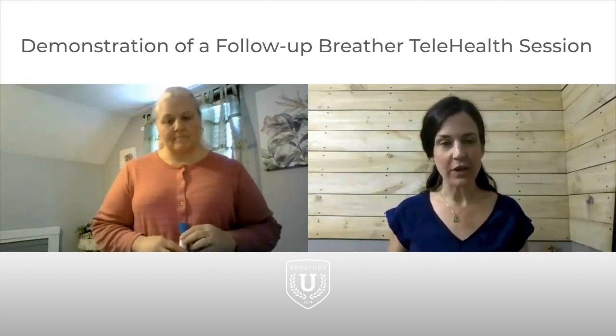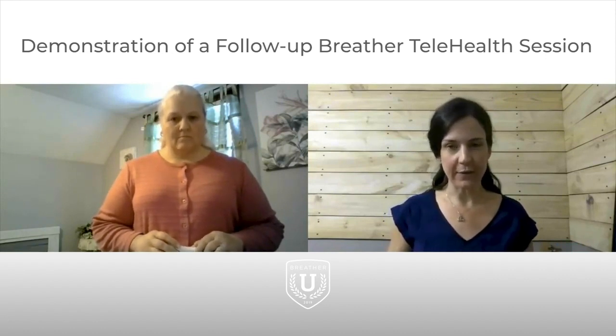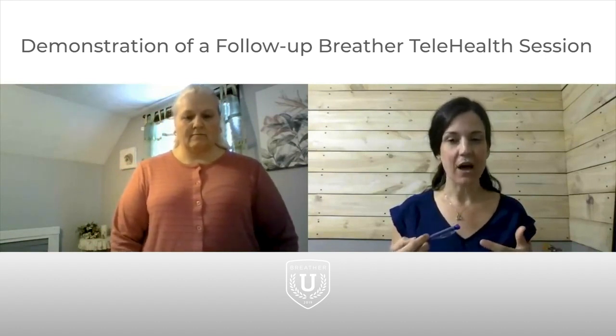Yes. Very good. Okay. Today, the first thing I want to do is check where you are on those measures that we did the first day on your evaluation so that I can see how you're doing with your progress. One of the ones we did was your maximum phonation time. So I'm going to ask you to take a deep breath and say, ah, as long as you can until you run out of air. Okay? Give me a second to get my stopwatch. I'll show you at the end. Whenever you're ready, take a nice deep breath and say, ah, till you run out of air.